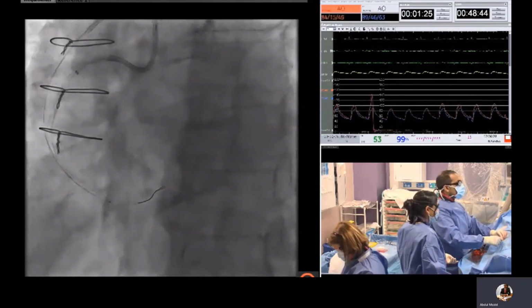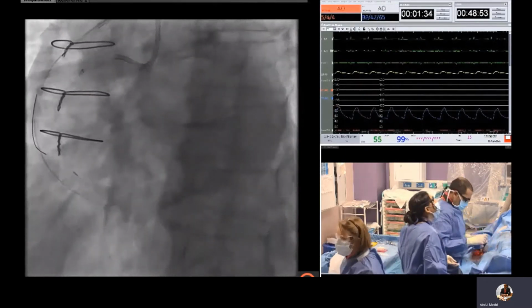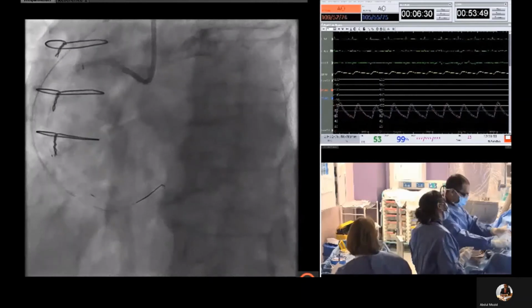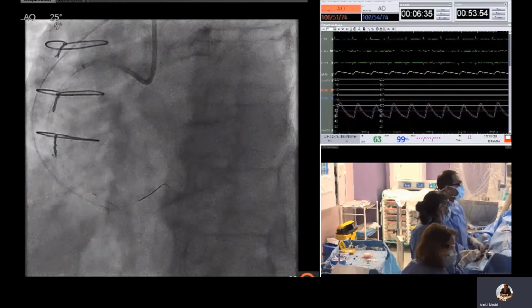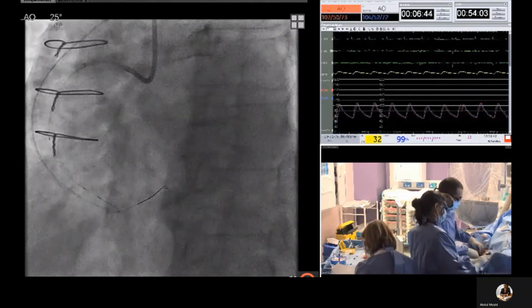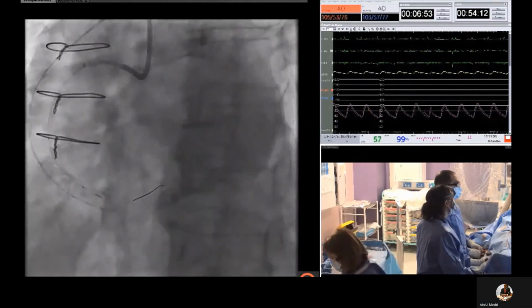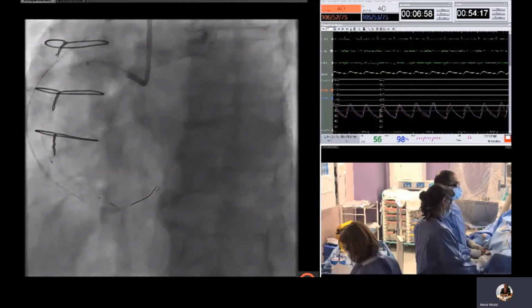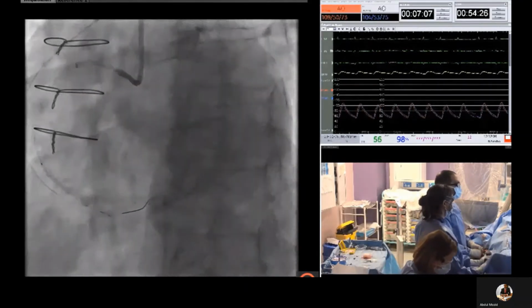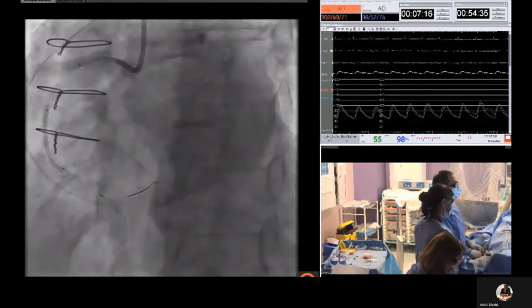After externalisation, the retrograde microcatheter can then be withdrawn. It is always important to keep an eye on the retrograde guide catheter, as this can be sucked in quite deep. We then pre-dilated the occluded segment. This is a 2.5 by 30 millimeter balloon. It's very useful having long balloons for this type of CTO work. The whole track is dilated.